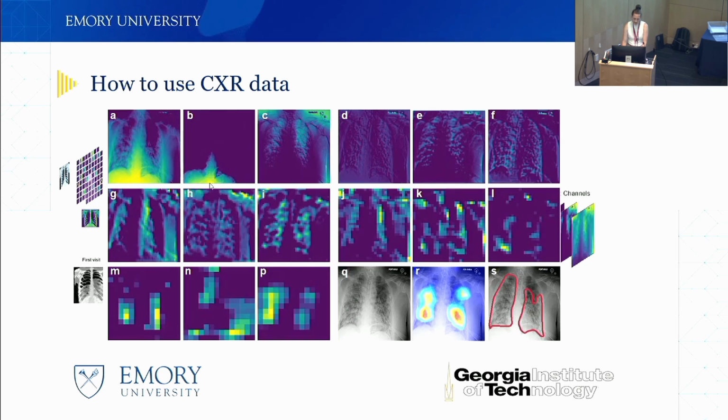Here I can still see that. If I look at M and P, I have no clue. This doesn't mean that much to me, but it is a good indication. Especially if you combine this, so R is basically the combination of all your filters. It is good to do them just to see if you're actually looking at what you're hoping you're looking at.